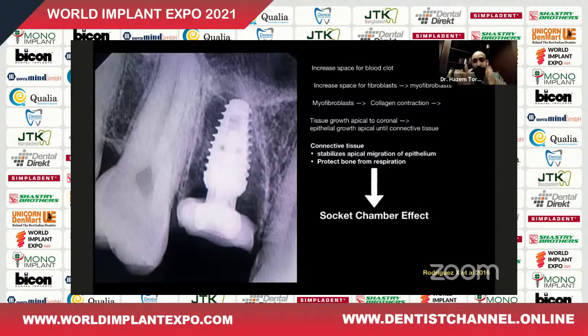And we can see here how narrow the abutment neck is, and we can see the mesodistal space, which is all around 360, how it provides more volume for the bone and the tissue attachment to form around the abutment itself. And we can see the biological width formation is in a supracrestal position and not in a subcrestal position.